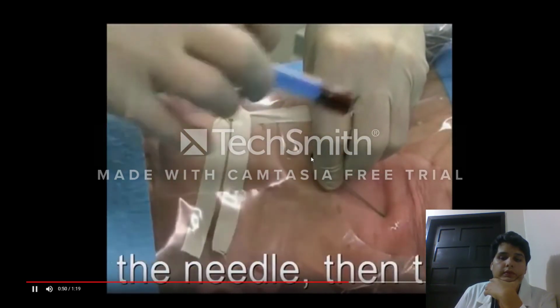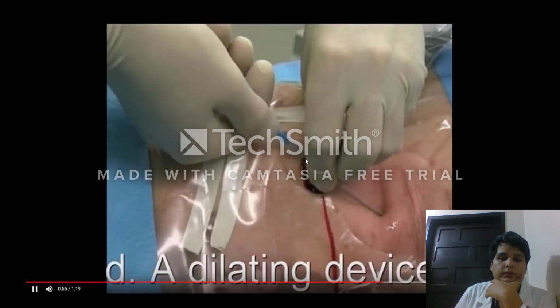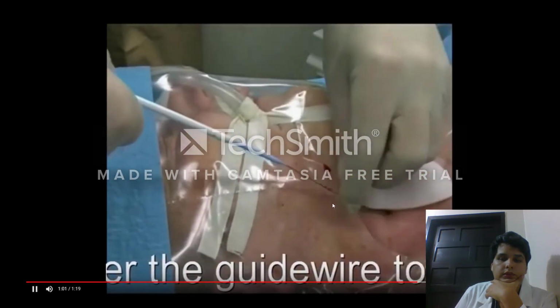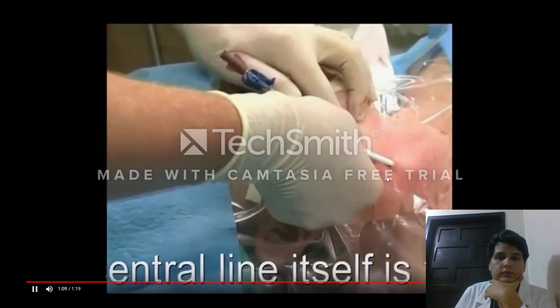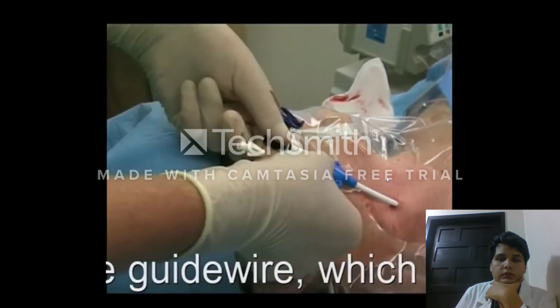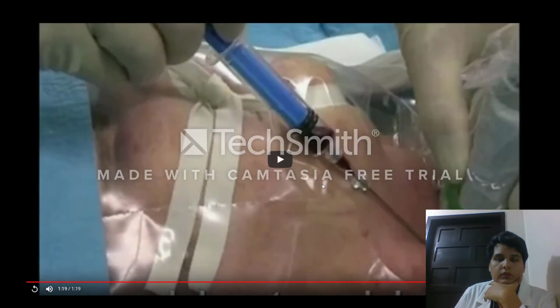You remove, and then you put the catheter. This is the guide. Here they go. That looked like it was for a dialysis. I don't know, but it looks like it.